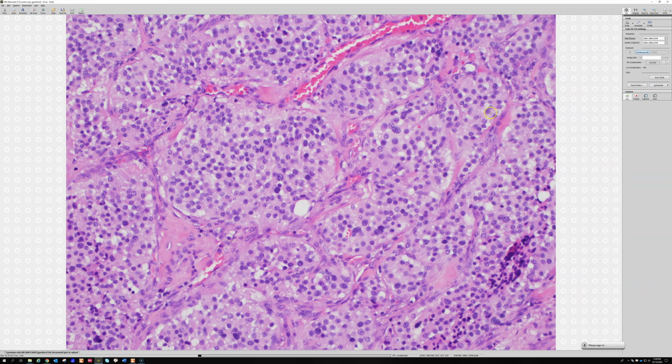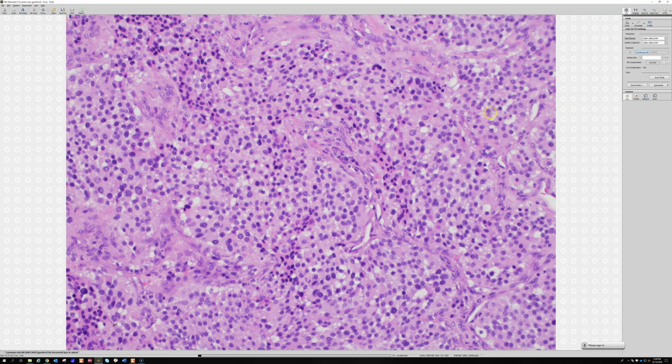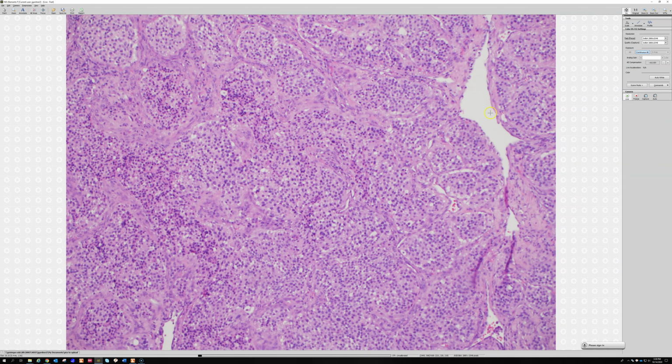I have seen occasional times where it was clearly a paraganglioma, but that stain didn't work very well. So when it works, it's great, but I feel like it doesn't always work as beautifully as it's illustrated in the books, let's say. And then usually keratin will be negative, but sometimes you can have some keratin expression.